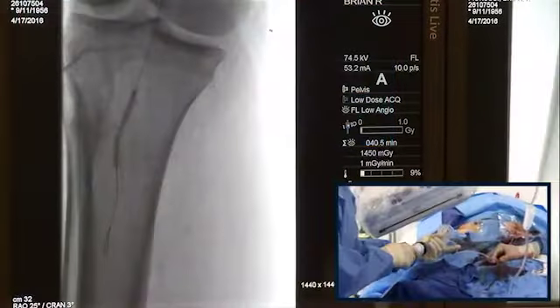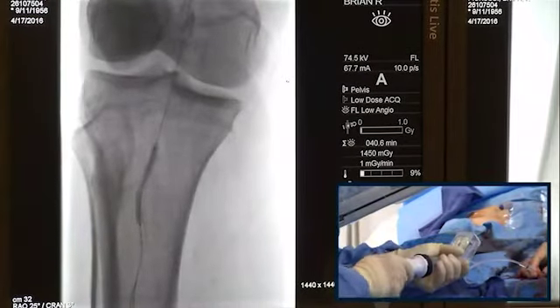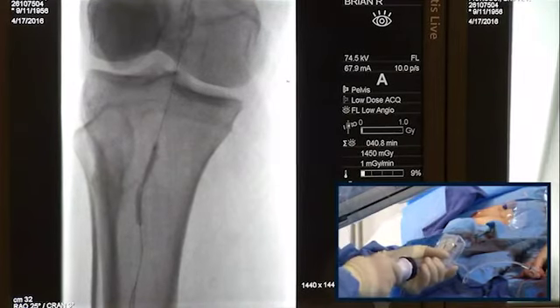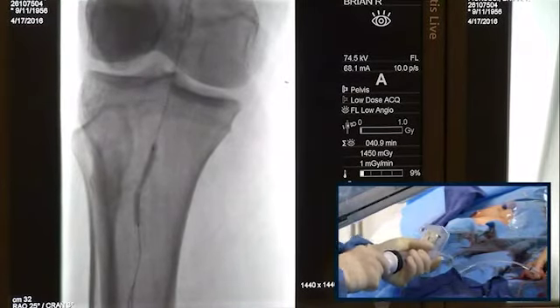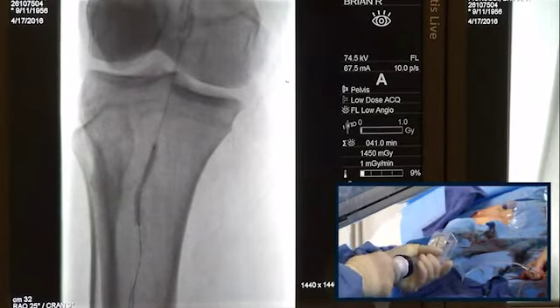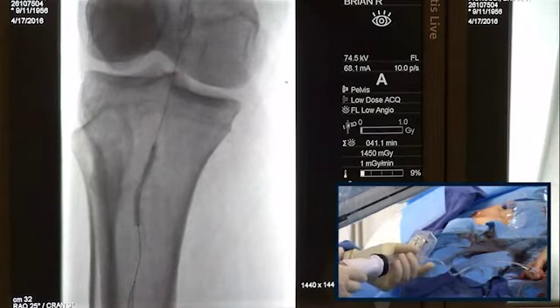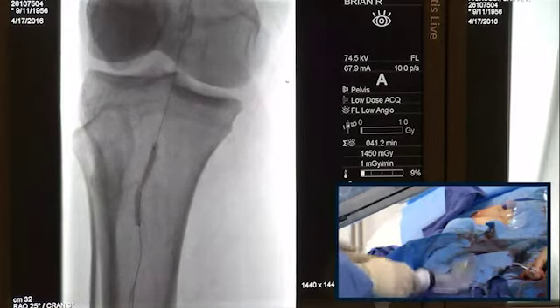Yeah, I know that potentially could be a theoretical advantage. It's just that we rarely go and suction these out. Even when we do, it's rare that we go with AngioJet, or I'm not sure some of the manual aspiration catheters have the power to take out calcium and chunks of plaque from embolization. Short of doing AngioJet or more high-level thrombectomy to suck those debris out, because it's unlikely to be clot. It's most likely going to be plaque and debris, and it may be some clot too, but it's going to be very fibrotic. So I don't know.